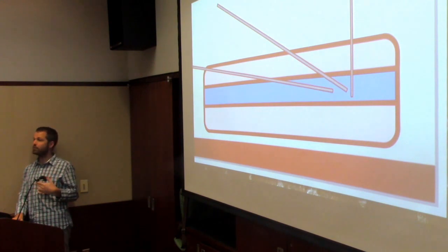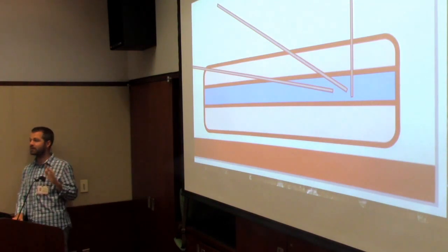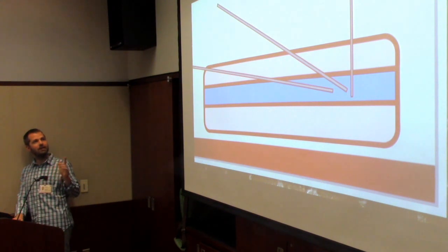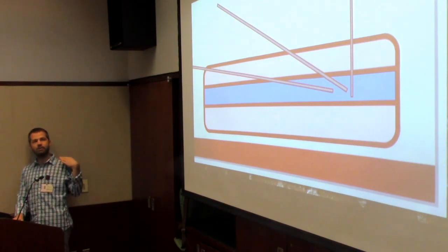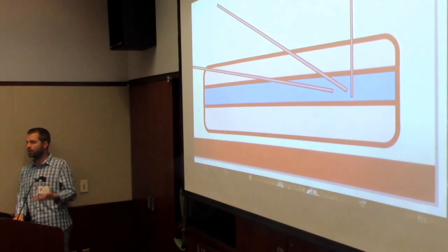Sometimes I'll go straight down if I'm doing it by ultrasound, essentially just to get into that artery, know exactly where I am, and be done with an ABG, as opposed to risking, I think, about 20% of the time, getting venous blood. Even if I'm convinced I'm feeling artery and it looks pulsatile, it's not worth the risk if you're just going to do it once to be done. And with these super low angle ones, say like an EJ, just know the risks and benefits and know how much further the vessel is going to be when you're doing these different angles, the odds of shredding the top, the odds of going through and through, and just know that they change with the angle you're going to take.